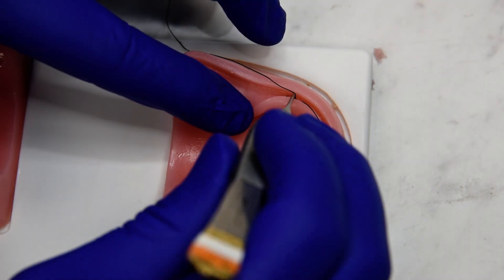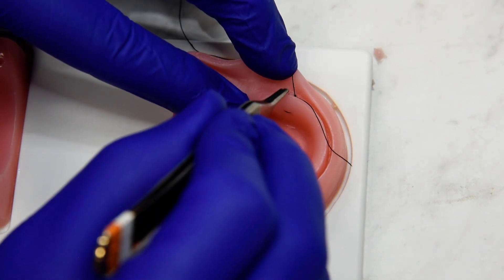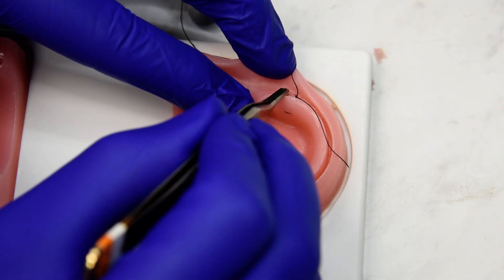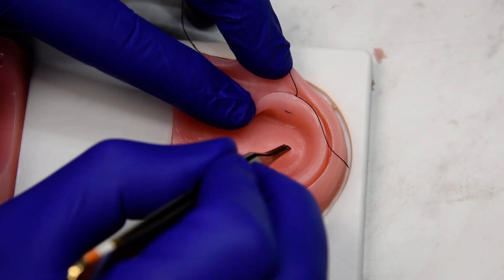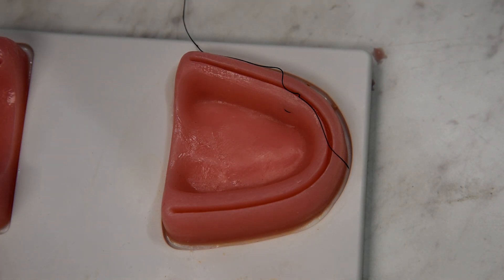So now we have a mattress that, if there was a membrane underneath it, would be strapped along the bone. That's the subperiosteal mattress.